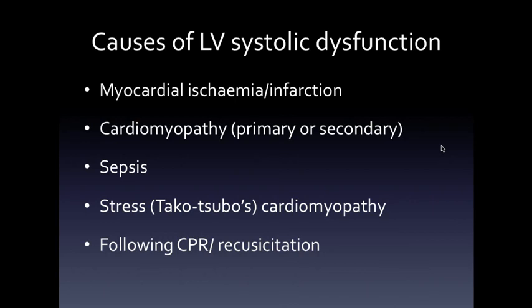And of course, following CPR, if you have a cardiac arrest for an electrolyte disturbance or an overdose, the heart looks sick after resuscitation. It's very hard, particularly now in the days of cooling, not from an echo perspective, it throws the ECG into wild sort of shapes, and it's actually harder to interpret after cooling, which clearly saves lives.